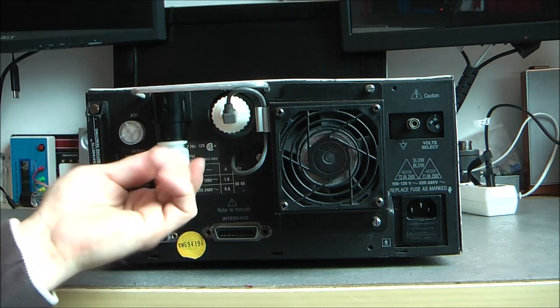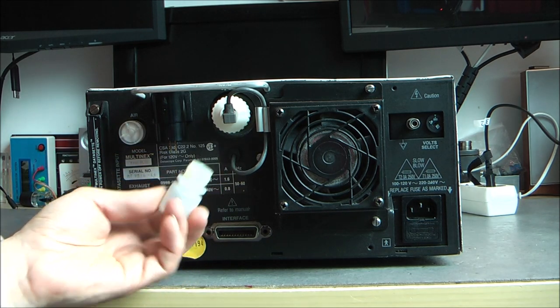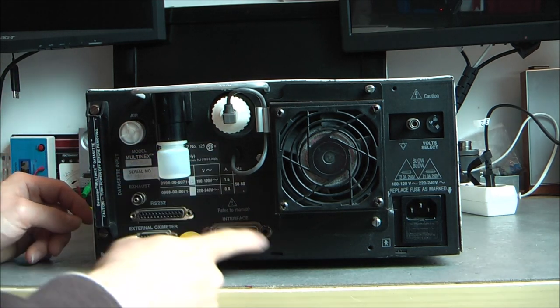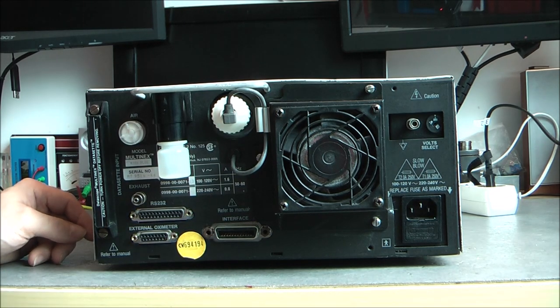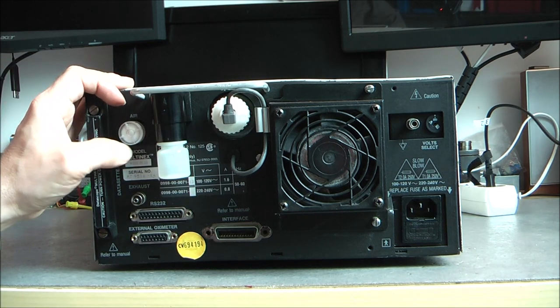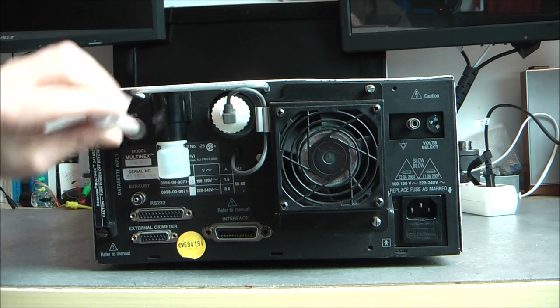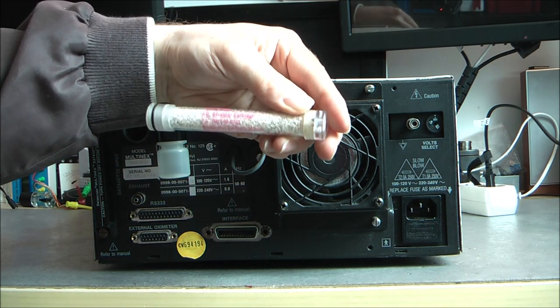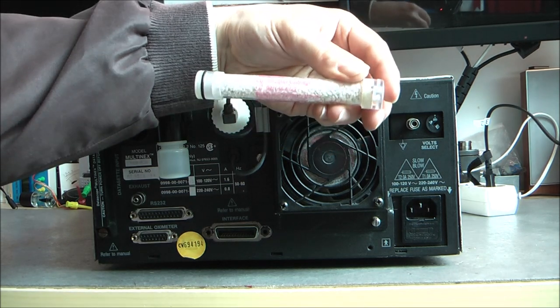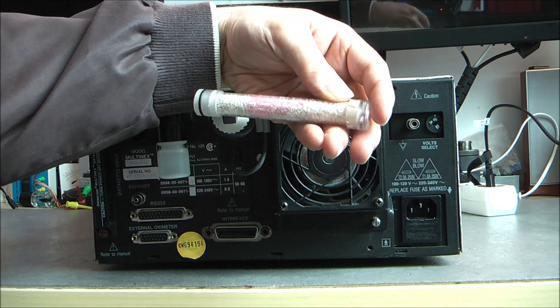You have here a waste fluid tank with two probes for overflow to detect the level. So it includes condensation water, I believe. Some interfaces to other equipment. Gas exhaust. Room air input to measure apparently the percentage of carbon dioxide in air through this filter. Oh no, in fact, it does remove carbon dioxide. It is called the Datascope CO2 scrubber cartridge. It contains crystals of soda lime.